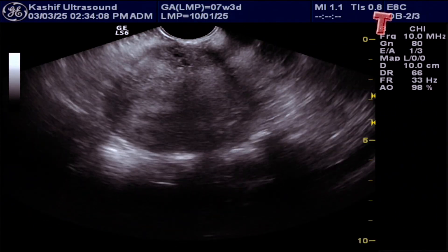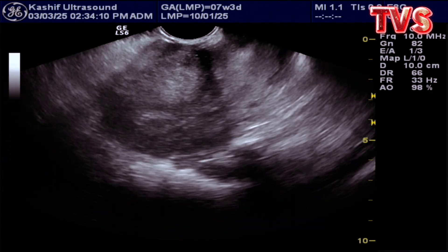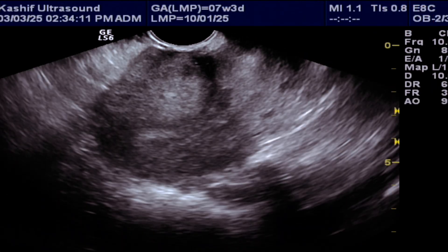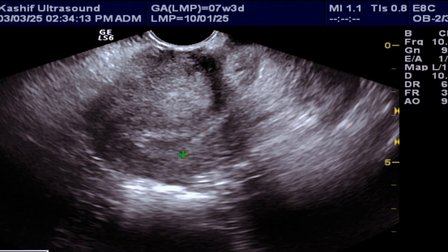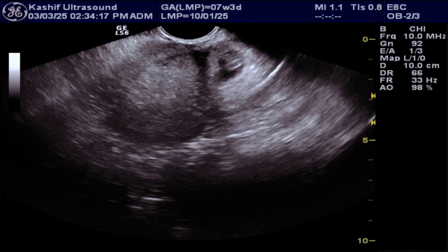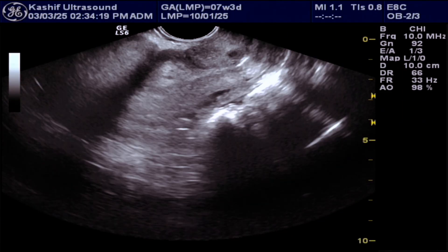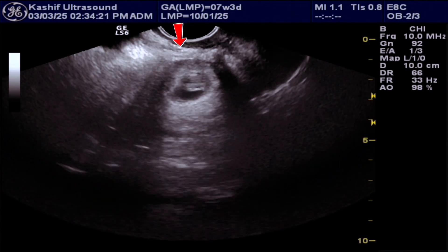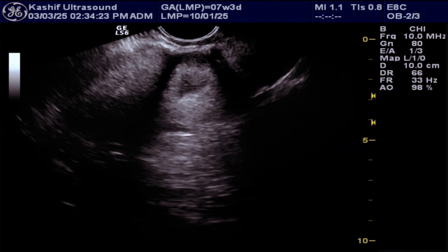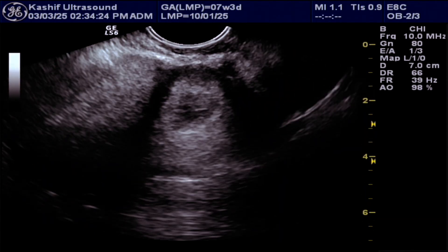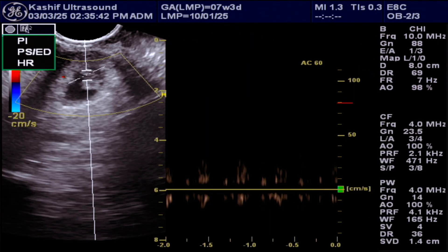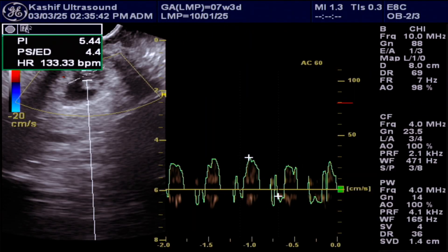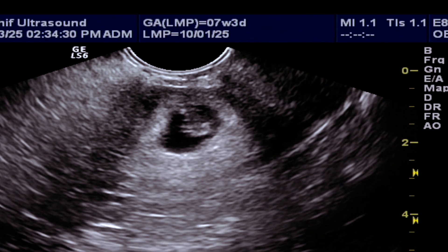Transvaginal ultrasound provides better visualisation. The endometrial cavity is well-defined and is empty. A well-defined gestational sac is visualised in the lower third uterine segment involving the anterior myometrium at the scar site. It has a live fetal pole with positive colour flow and heartbeat. There is marked thinning of the myometrium anterior to the gestational sac.